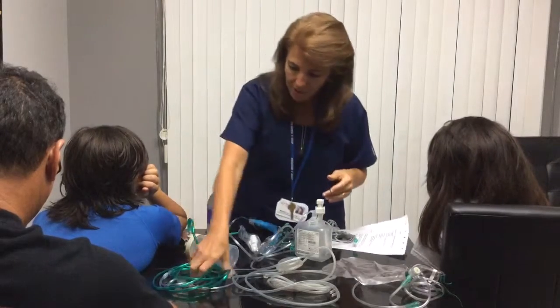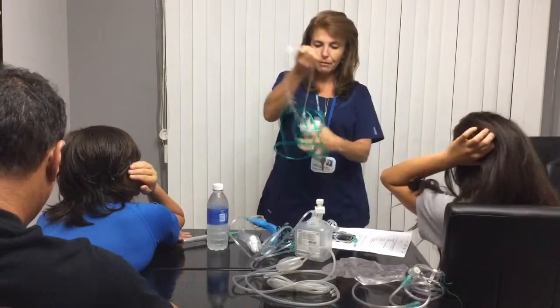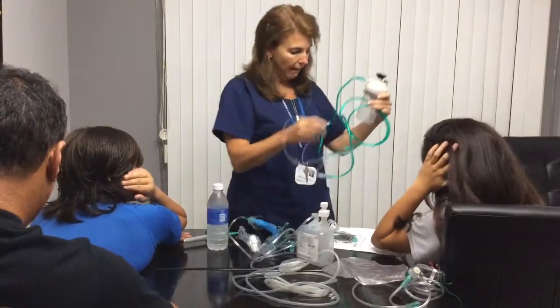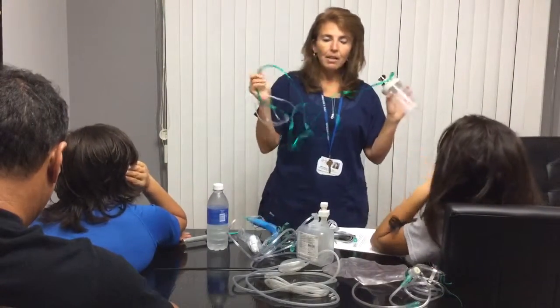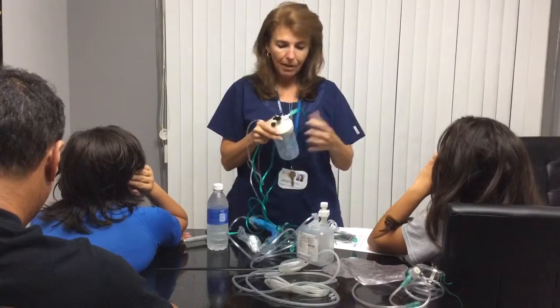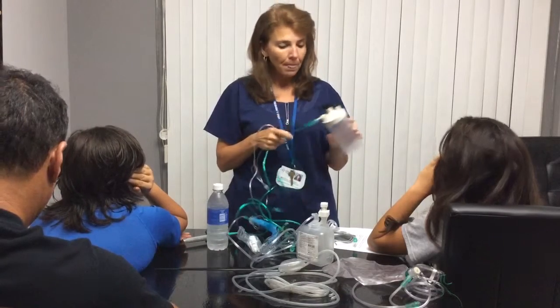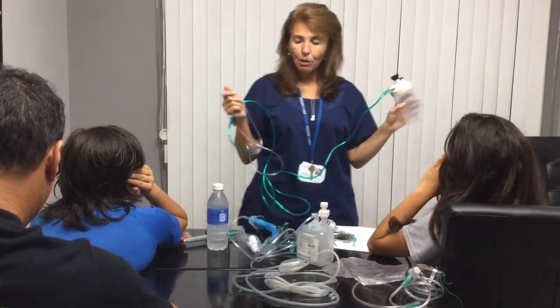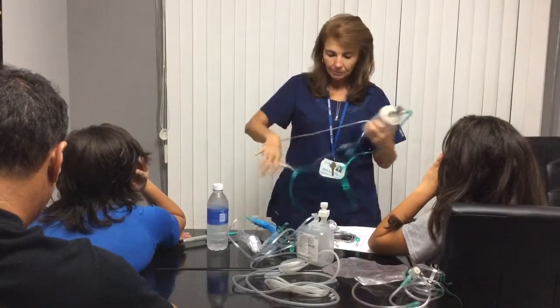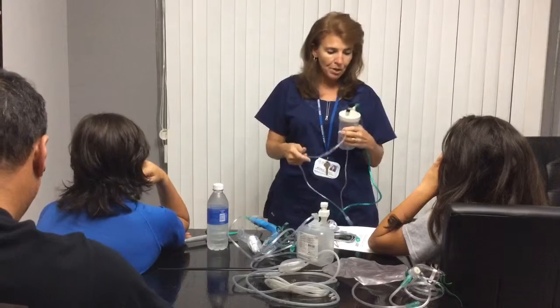So the first high flow system is the high flow nasal cannula, and as you can see, it does look a little different from our basic cannula, and the coloring is green. This type of cannula is always humidified with a special humidifier that has a pop-off valve so it can ensure adequate flow. 6 to 15 liters is the flow for this type of cannula. The material is pretty pliable, so it's soft and comfortable for the patient to wear.